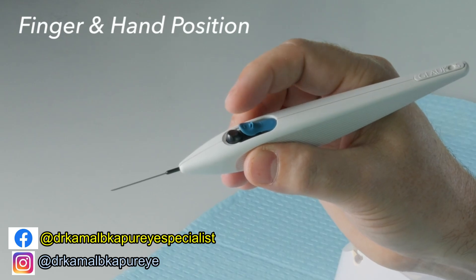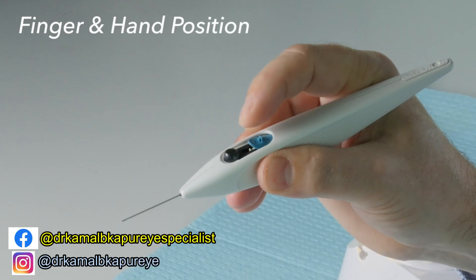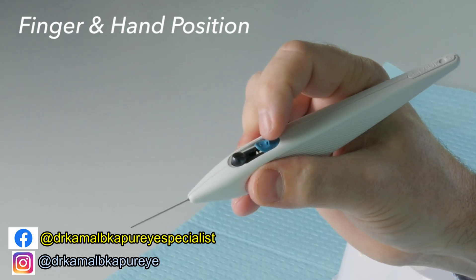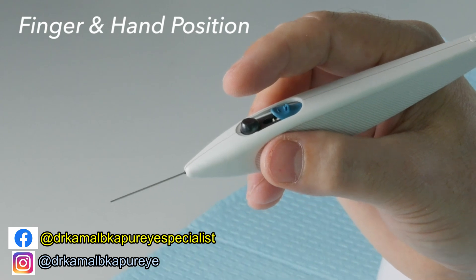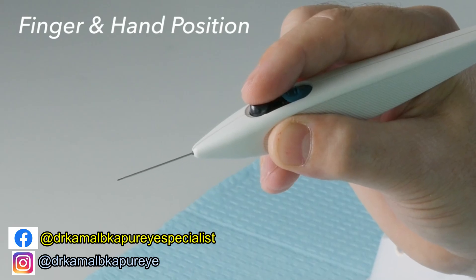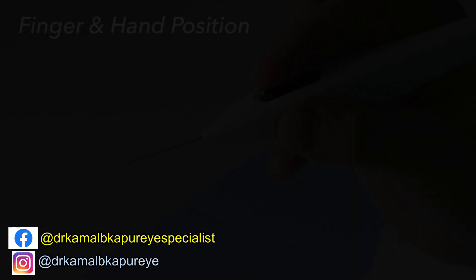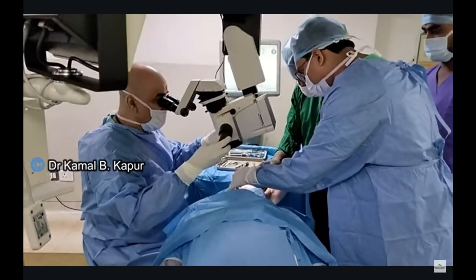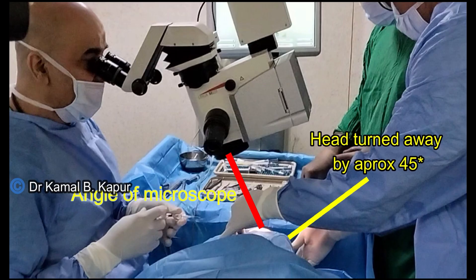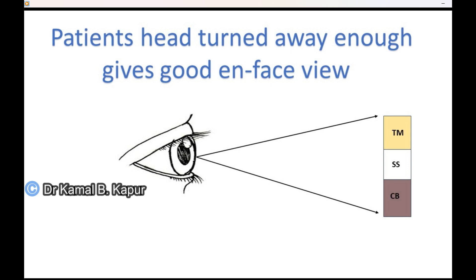There is a particular technique for how to hold the injector. The injector is held between the middle finger and the thumb of your dominant hand. Make sure that the pressure of the holding is on the thumb and the middle finger, while your forefinger is very soft and free to push both the retractor and the firing button. The force exerted by the index finger has to be minimal, otherwise it will cause bending of the injector plunger.